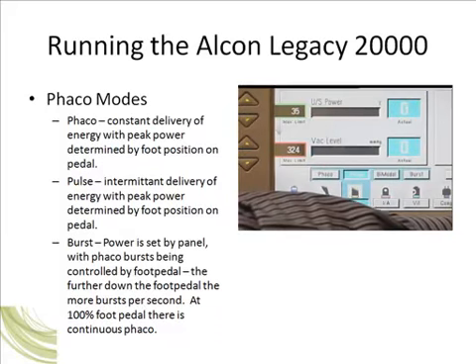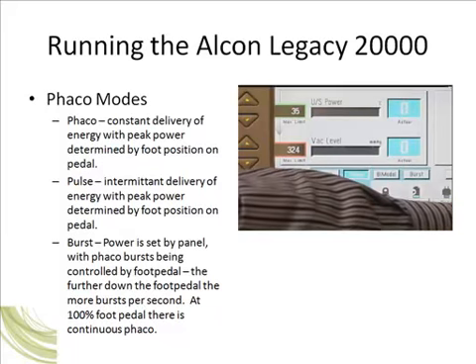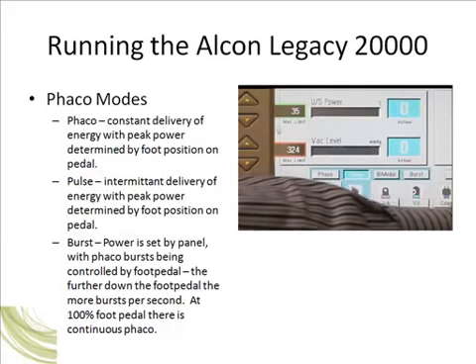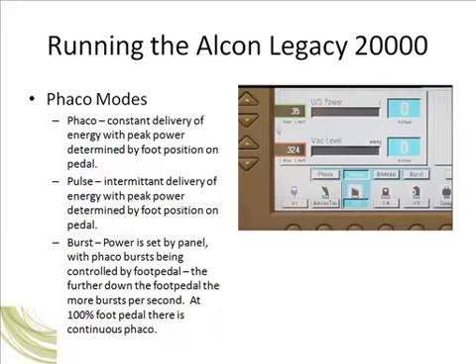In phaco mode, there will be a constant delivery of phaco energy, with the power delivery determined by the foot position on the pedal and the peak power determined by the panel preset. Your phaco energy is constantly on 100% of the time in this mode, so there'll be a continuous hum from the phaco handpiece. One of the downsides of this is that the phaco handpiece can sometimes become hot and result in corneal burns if you're not careful. This has prompted the development of some other modes of delivering phaco energy.